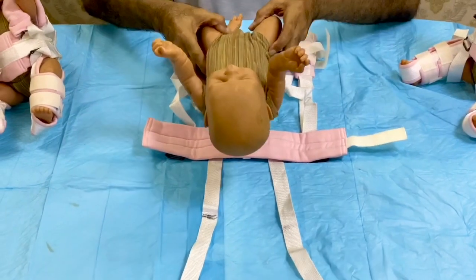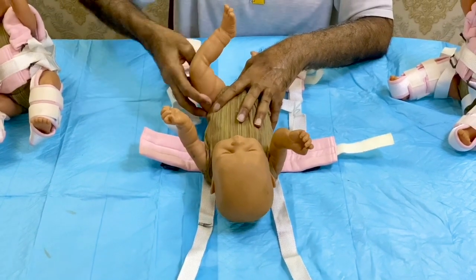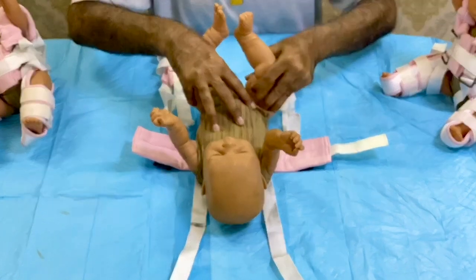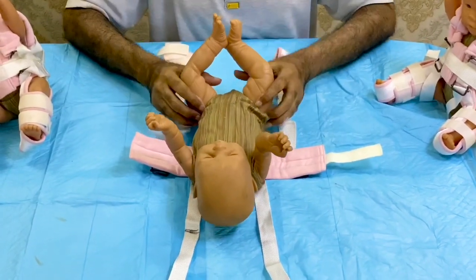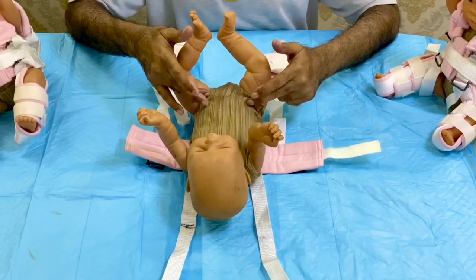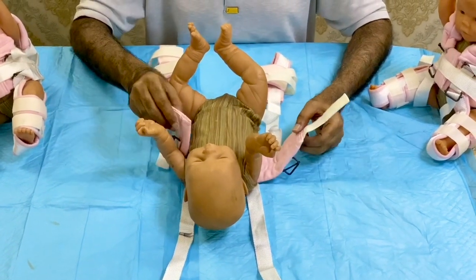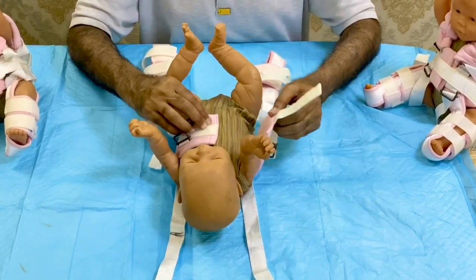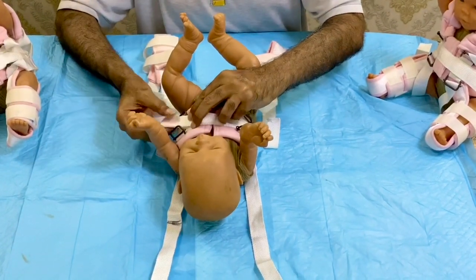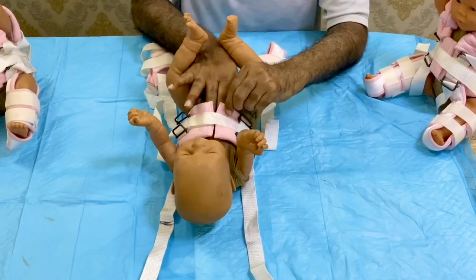We have to reduce the hip — you must train the mother how to reduce the hip and maintain the position as per need and as per reduction. Give the baby seasonal clothes and a nappy on first, then start with the application of the chest halter, which should be not so tight, not so loose — at least two finger space must be there.